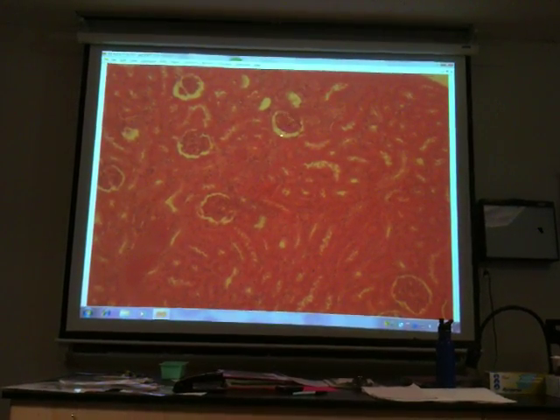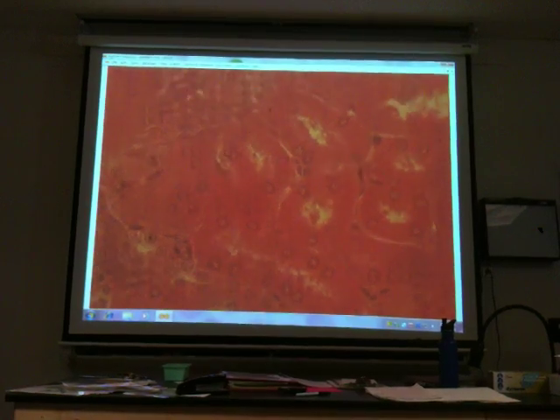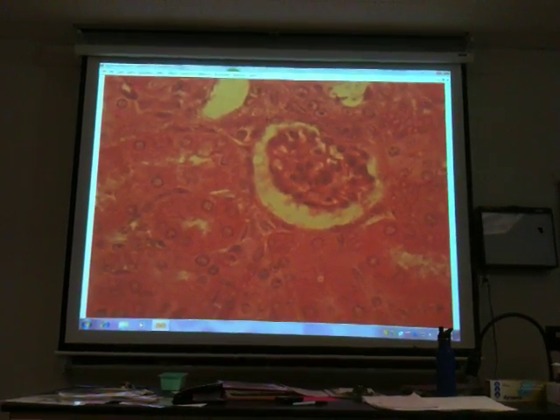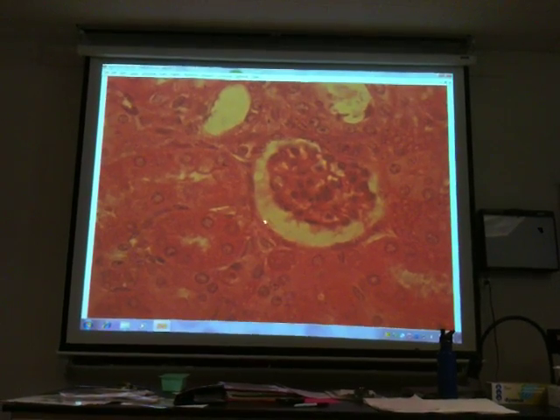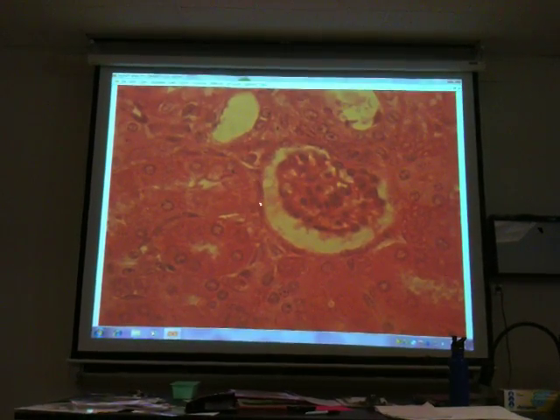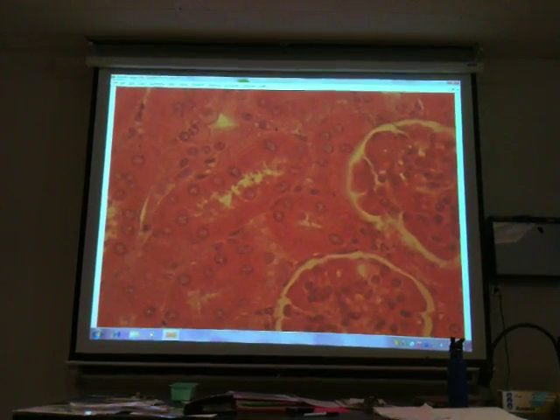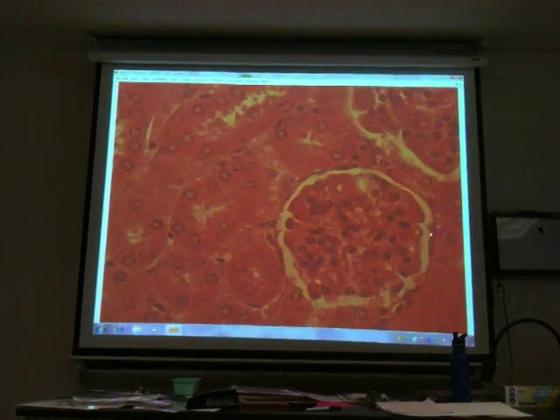renal cortex. This is a renal corpuscle, and you can't separate the glomerulus visually from the visceral layer of the Bowman's capsule, but what you can do is you can see the parietal epithelium opposite the capsular space from this central mass that includes glomerulus and the podocytes. So the parietal or capsular epithelium is fair game. I would look around and find a better one where you can clearly see some of those really squashed nuclei of the simple squamous epithelium.